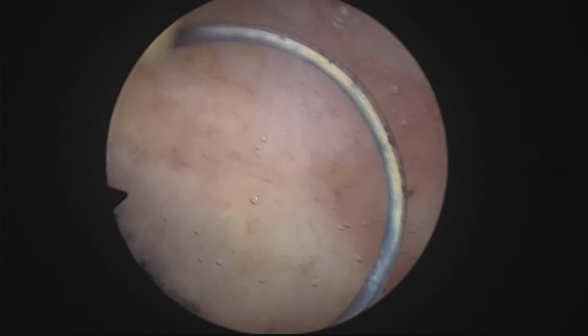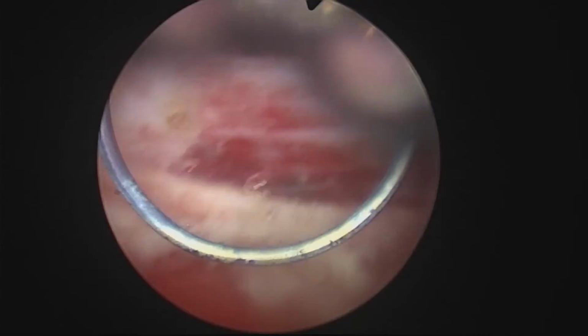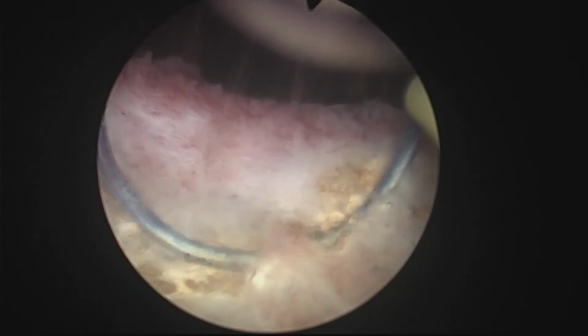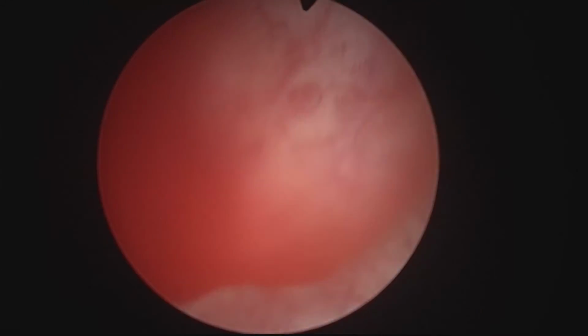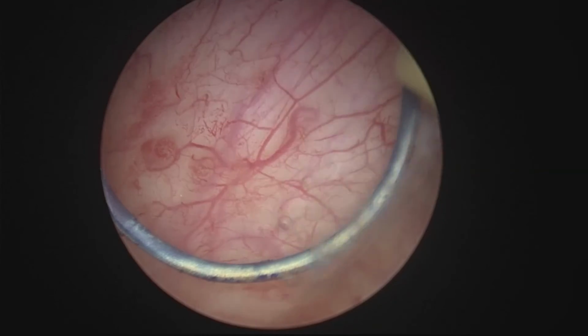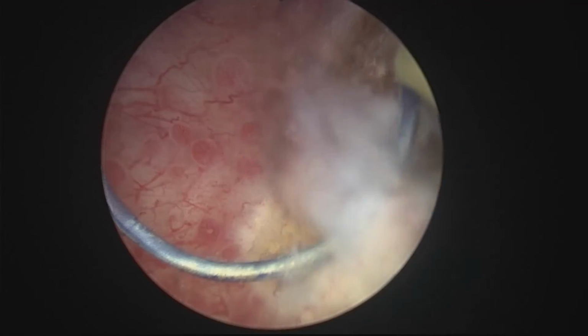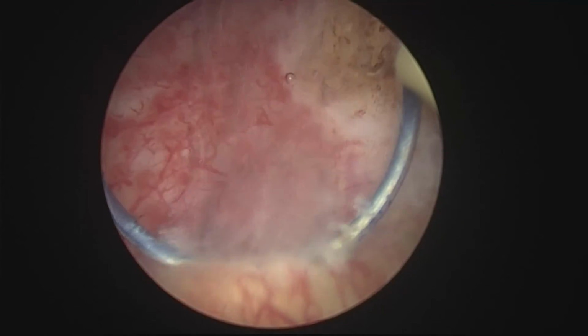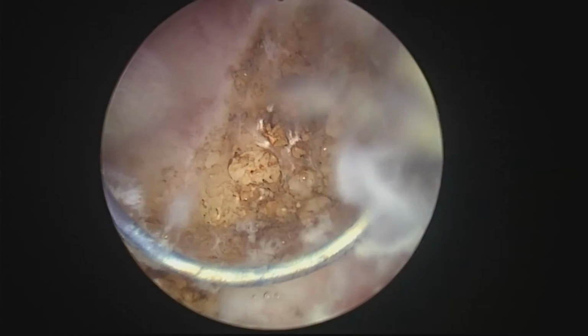But yeah, nothing serious. So I just wanted to have a little bit better visibility in the bladder. That was clot that was already forming. This is bladder neck. Okay. So now where are you again? Here. So this is the interesting part, I think, of this video, and this is the endoscopic treatment of a diverticulum. Hoping that this is only inflammation, I'm going to fulgurate the whole mucosa of the diverticulum.